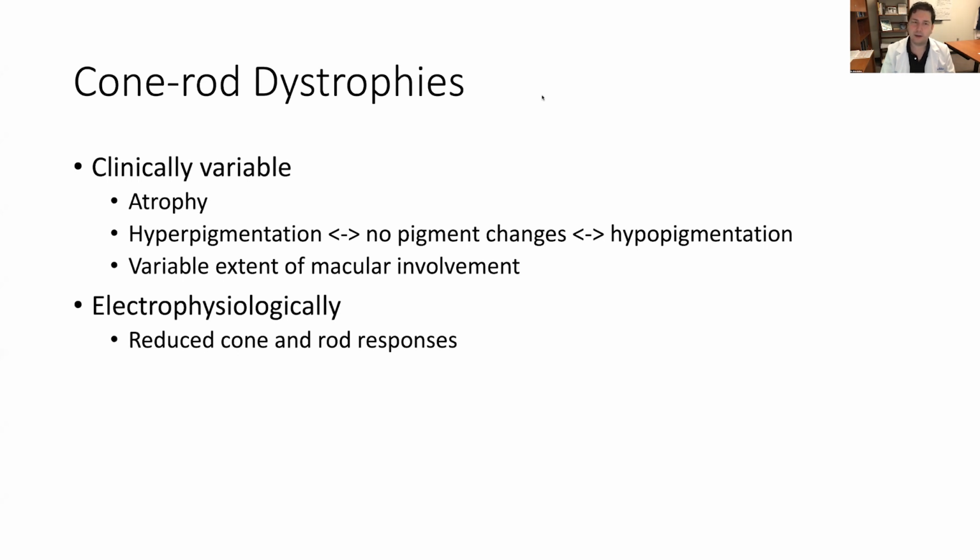And in order to make these diagnoses, electrophysiology becomes your friend. Very important to be able to do a full field ERG on these patients to demonstrate reduced cone and rod responses and put that together with your clinical picture and what you're seeing.